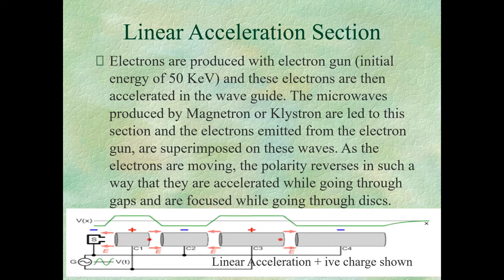And in SBRT and SRS, hotspots of 20% or more are not only acceptable, but they are desired. Keep them in your GTV, remember that. So this forward peak gives us a hotspot. It helps us to get a hotspot of 20% or more for our SBRT treatment tumors as well.